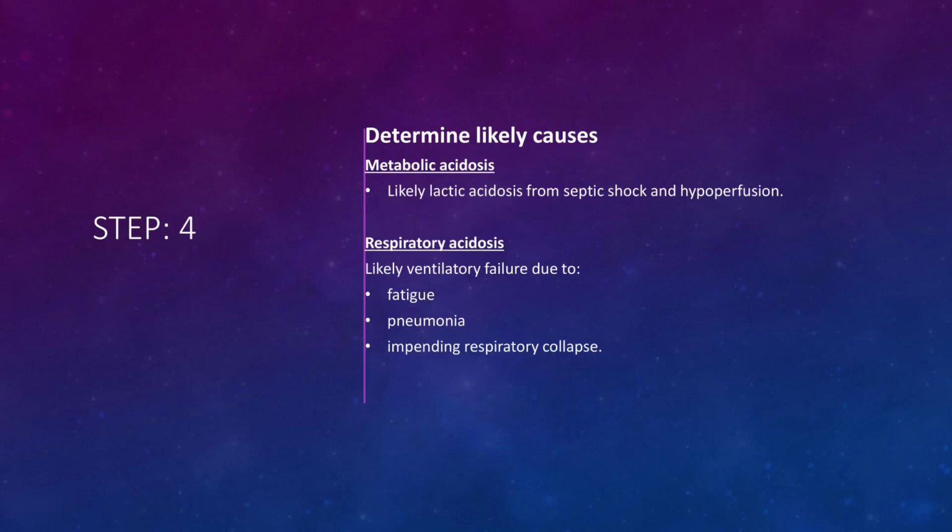Step 4. Determine likely causes. In this patient, metabolic acidosis is likely due to lactic acidosis from septic shock and hypoperfusion. Respiratory acidosis is likely ventilatory failure due to fatigue and denotes impending respiratory collapse.